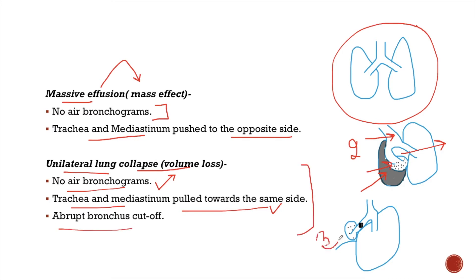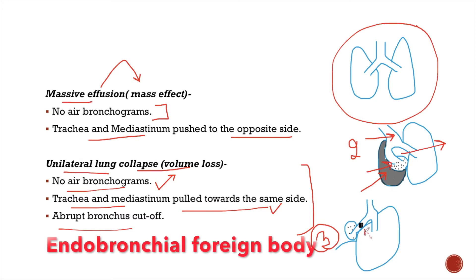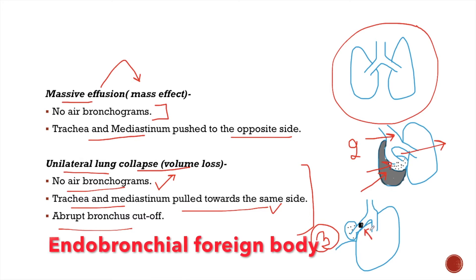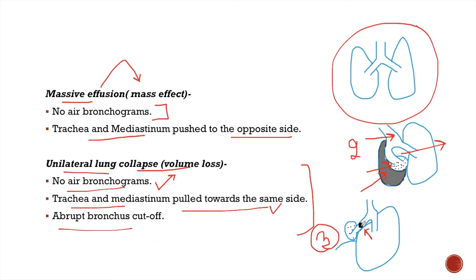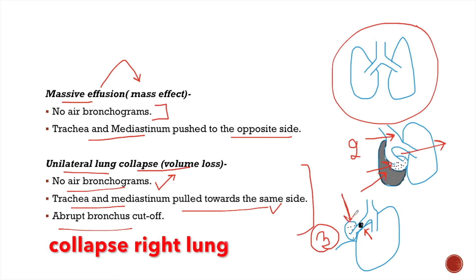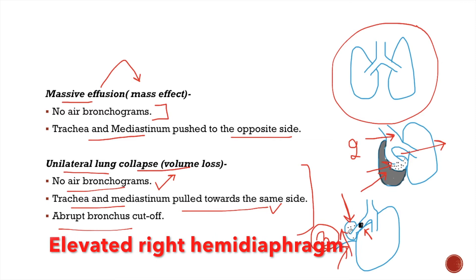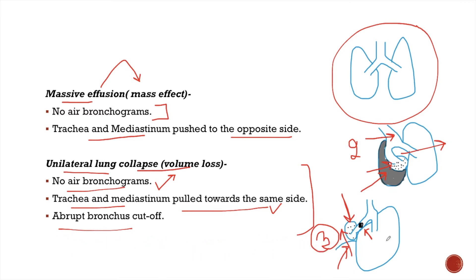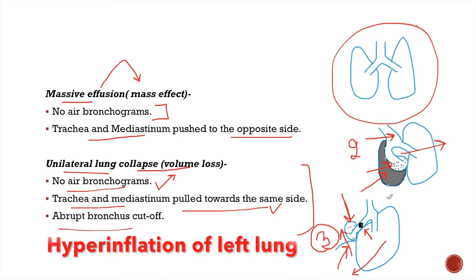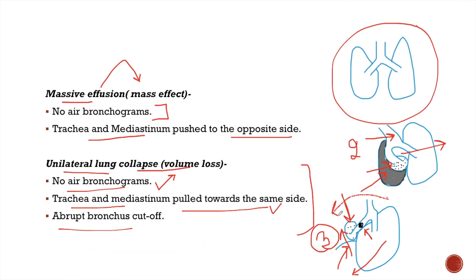Take this third image as an example. In this image, we can see that there is an endobronchial foreign body in the right main bronchus. This endobronchial foreign body has caused obstruction of the right main bronchus and the right lung is collapsed. There are features of volume loss of the right lung: elevation of the right hemidiaphragm, hyperinflation of the left lung, and deviation of trachea and mediastinum towards the right side.